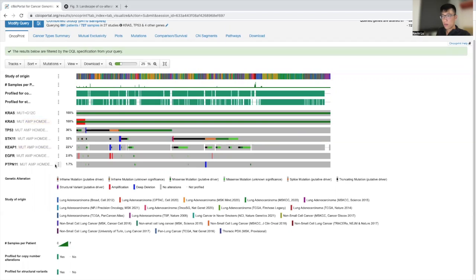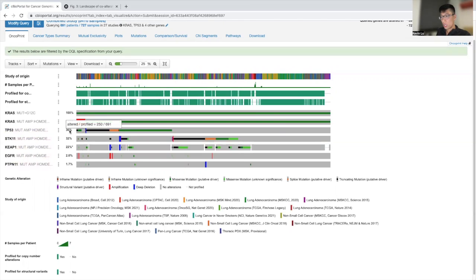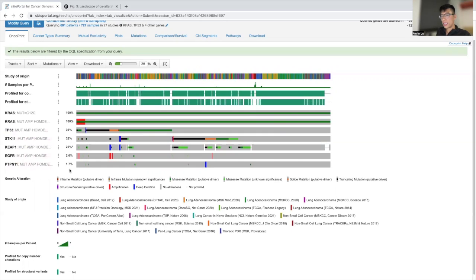In addition, we sorted by TP53, STK11, KEAP1, EGFR, SMARCA4. And as you can see, these are the frequency in which these genes are mutated within this KRAS-G12C cohort that we selected for.